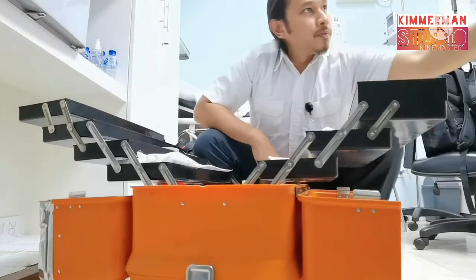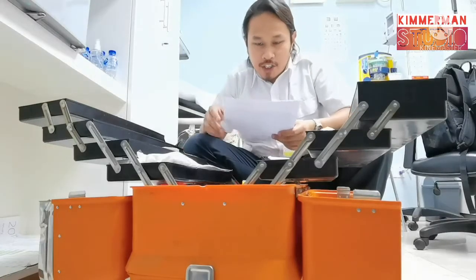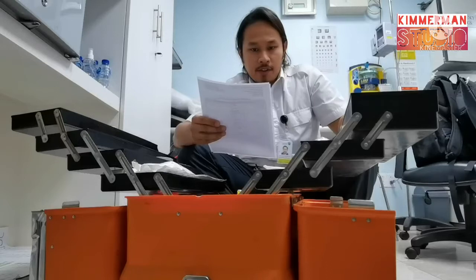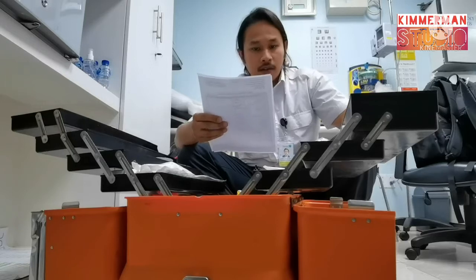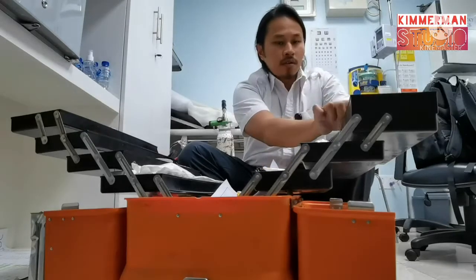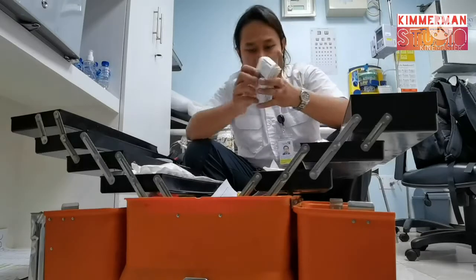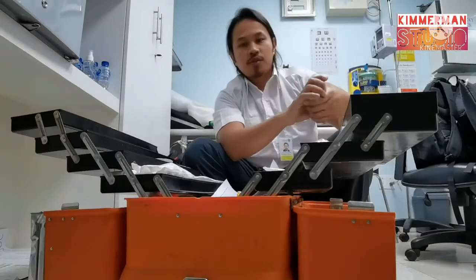On the top shelf here, we have a list as our guide and our checklist. On the top shelf, left side, we have these small bandages, Curlix rolls, these alcohol swabs, and small bandages. Small gauze squares.